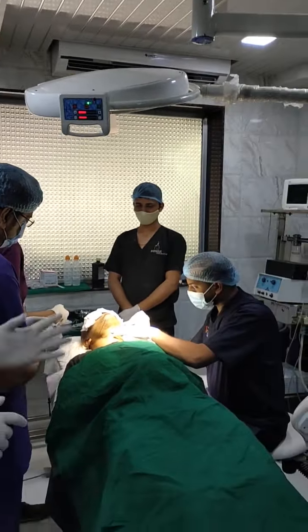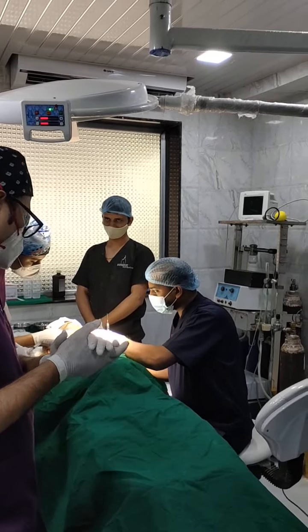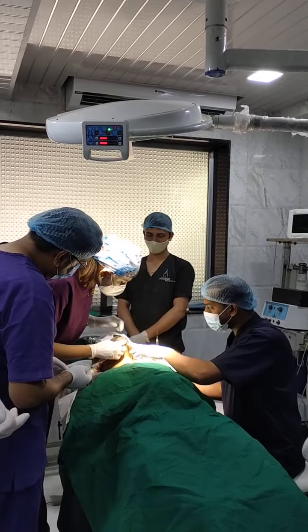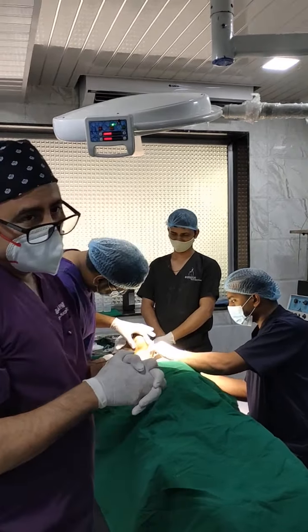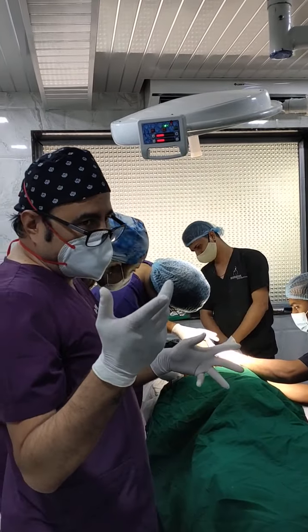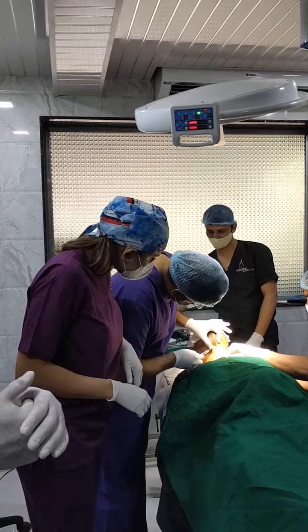And that's how we are doing our training program for the 3 days of the hair transplant and hair restoration workshop with all our surgeons around. So let's finish off with this anesthesia, and then probably we'll come back to you guys to show you how we do the extractions in this area.